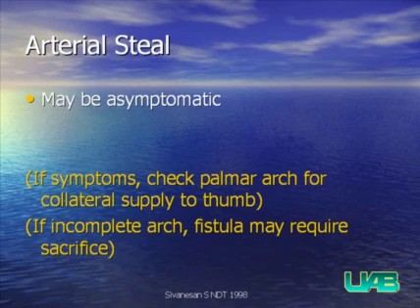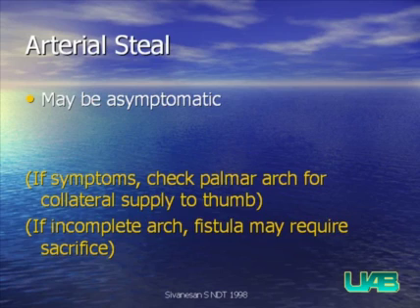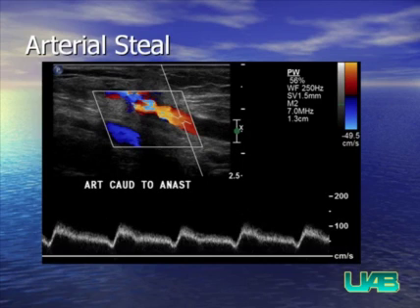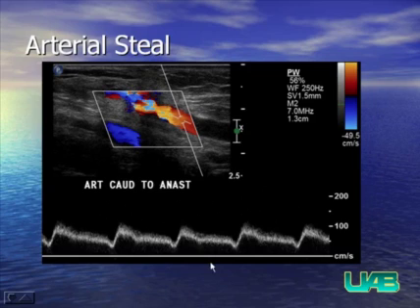Sometimes with a very successful fistula, there may be sumping of flow from the distal artery, taking blood flow away from the hand or forearm. Usually these are asymptomatic. However, if there are symptoms, a modified sonographic Allen's test should be performed, checking flow from the ulnar and radial arteries to ensure a patent palmar arch with collateral supply to the thumb. If the arch is insufficient and symptoms are present, occasional revision or even sacrifice of the fistula may be necessary. This example shows reversal of arterial flow beyond the anastomosis, with flow heading toward the patient's head in a reversed fashion.